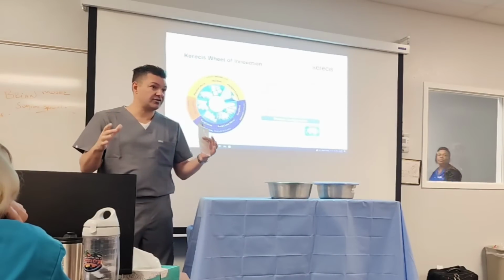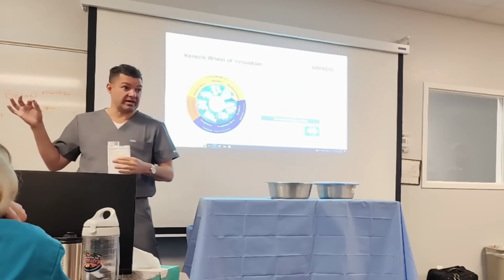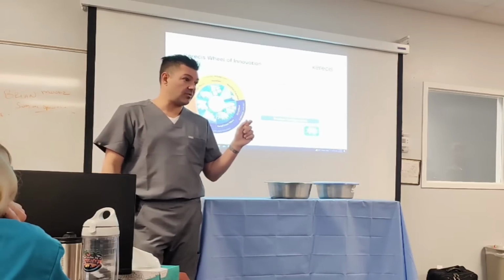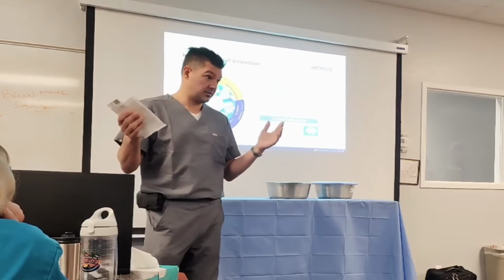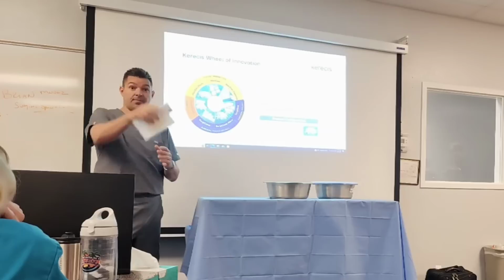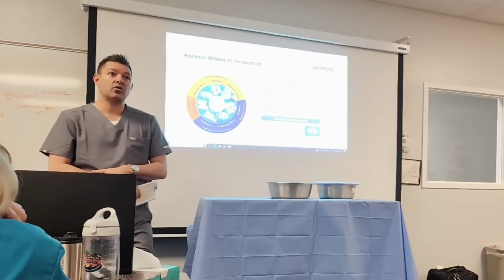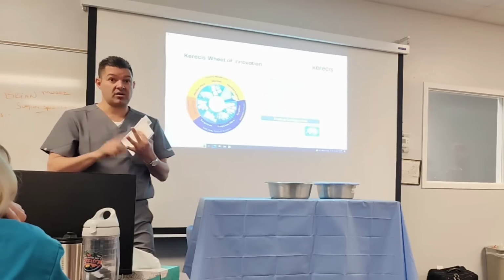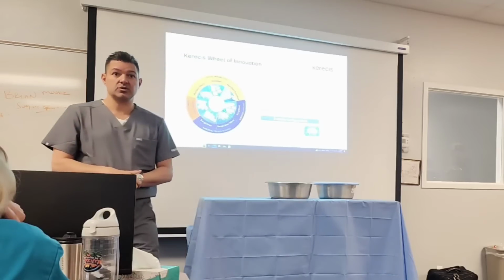Again, when we place this cod fish skin into the patient, depending on the anatomical structure, it'll automatically incorporate. It is not being removed later. So the incorporation will usually last in the first 24, 48, 72 hours of beginning to incorporate, and it usually fully incorporates within about 7 to 10 days. Full incorporation. Yes, ma'am. Aside from an allergy, what are the chances of rejection? You know, the only thing is we don't promote the product if it's infected. That's a big piece. But we're growing this on tendon, on bone, so we're really making a lot of headway. But if it's an infected wound, we tend not to place our product on that.